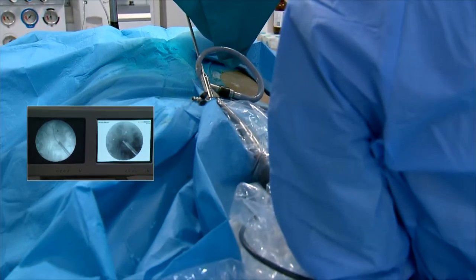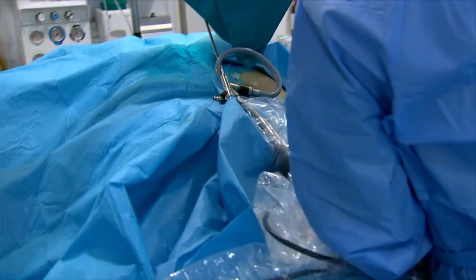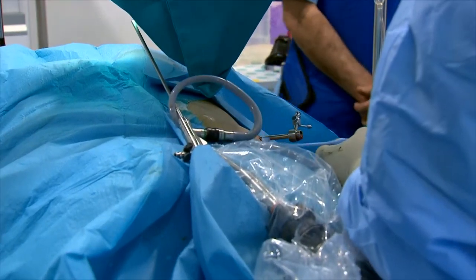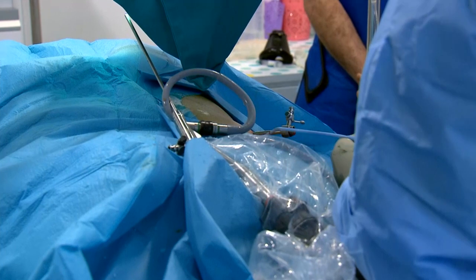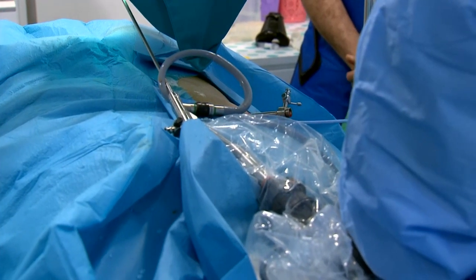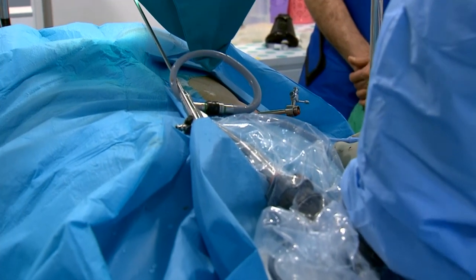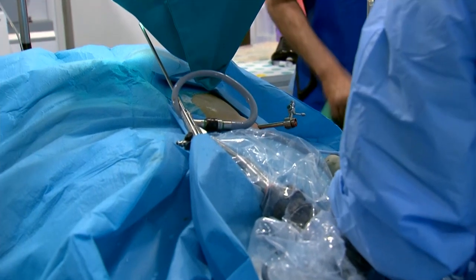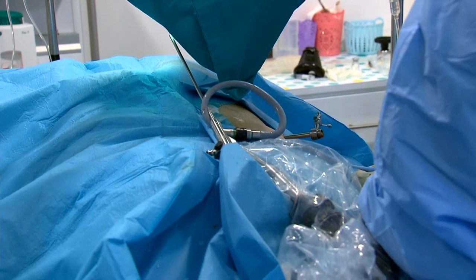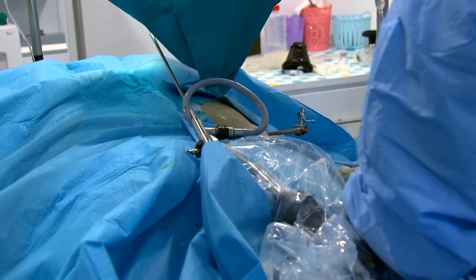They think that it would have been better to put the nephrostomy in the second tract. What do you think? Because it was a little bit traumatic, no? X-ray? Is this contrast? No. Wait. Okay, no. Wait. Was this contrast? This is contrast? No, once more.